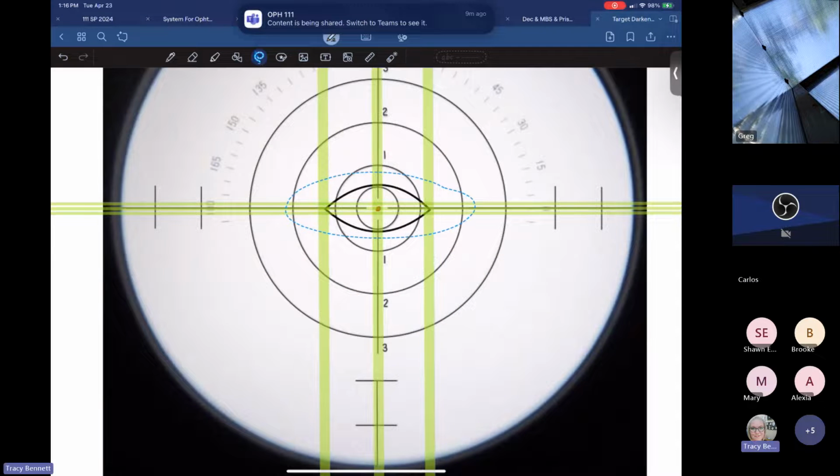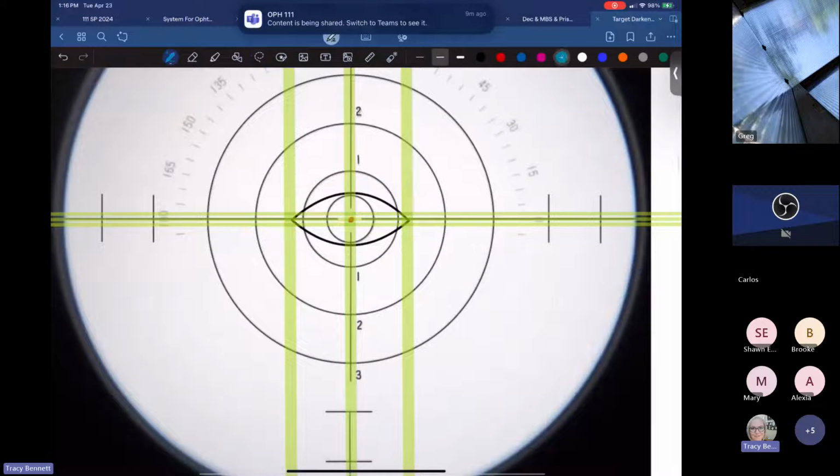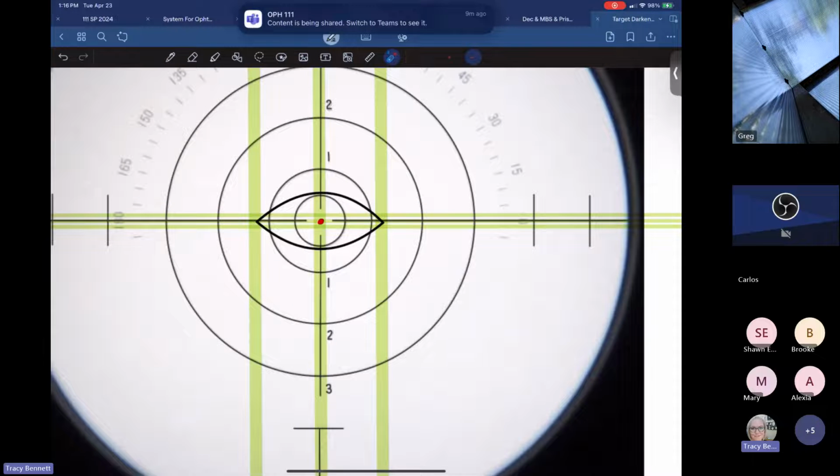Yep. All right. Then you have in and out. If you just figure out where's the nose, in and out becomes pretty straightforward. Again, remember that wherever this little line box goes, wherever that target goes, that's the base of the prism. So if this is a right eye, the nose is over here. So the right eye has the nose on the right.